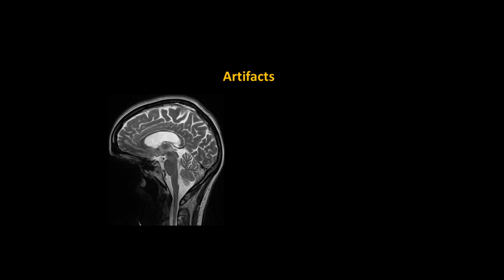This is actually a permanent retainer issue. So this is something that's not going to be attracted to the magnet. It's not going to be ripped out of your face or anything. But it will lead to these susceptibility artifacts and signal loss in that region. Now, standards differ. When I used to do my graduate work at Indiana, we would allow people to be scanned if they had a permanent retainer on their bottom teeth. We considered that okay because it didn't lead to any noticeable distortions in any parts of the brain that we were analyzing. Standards may differ from institution to institution.